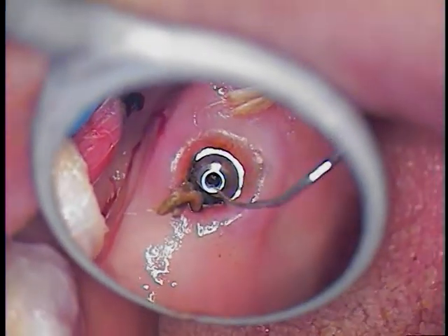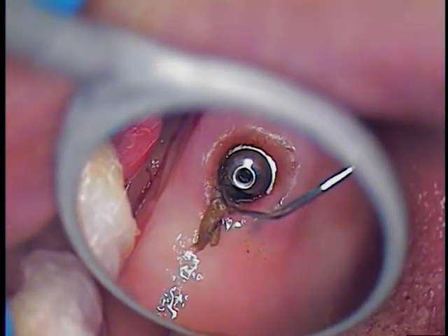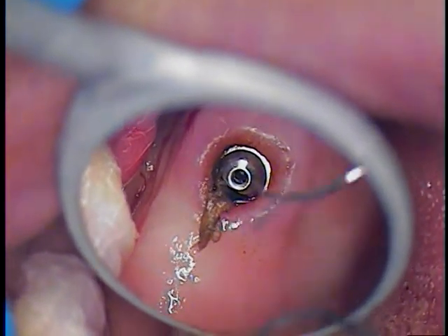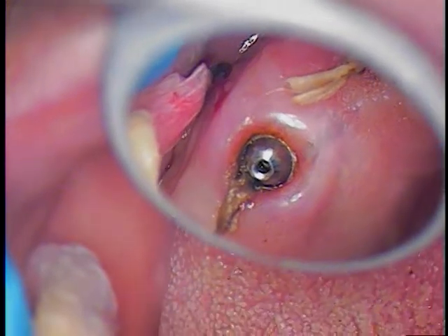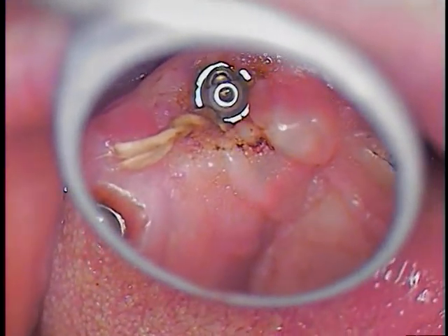Right now it's quiet. We'll put the patient on antibiotics, and then first thing when he gets back home, he can see the periodontist about this left side. So I'm going to go ahead and remove each one of the cords and just go right in with the new appliance.